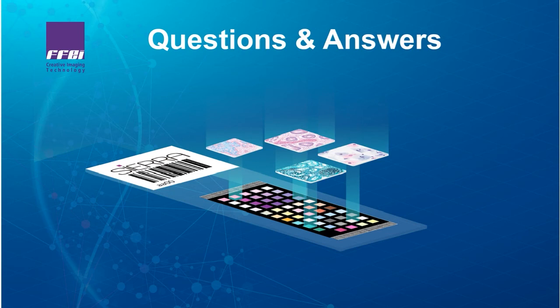And then also, I guess the driving force of it, as you mentioned, it's likely to be very influential on the standardisation of AI. However, in the reality of a growing pathology field, it's quite clear that to make sure you've got your standardised data for your QA purposes, that you know at every step of your end-to-end pipeline of pathology you've got quantitative accuracy, lends weight and confidence to the pathologist as they go forward into diagnostics.